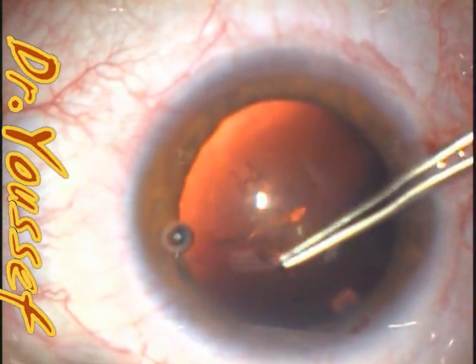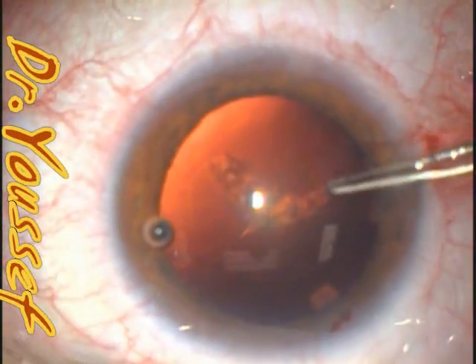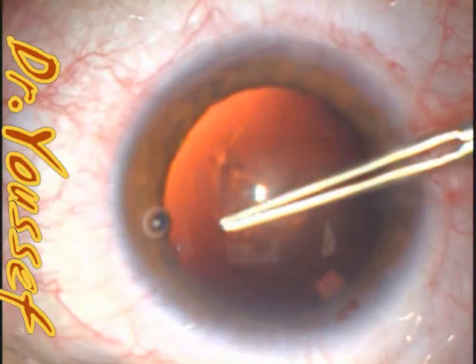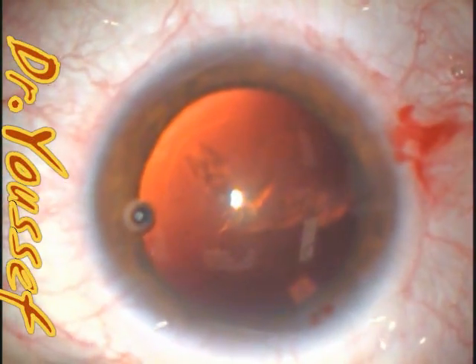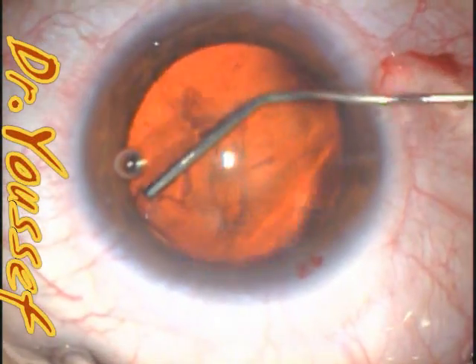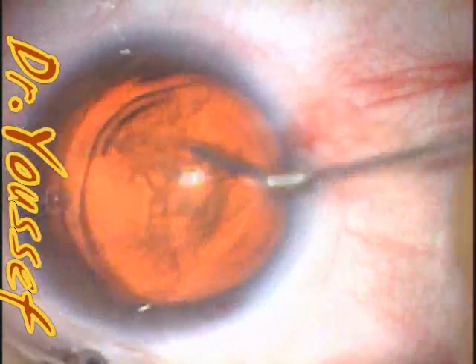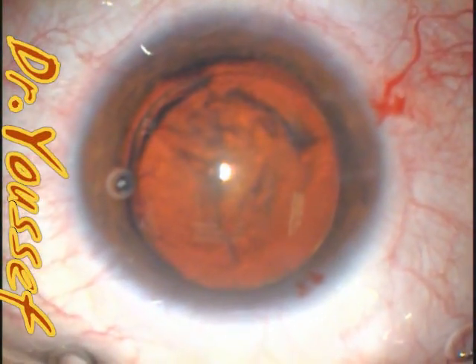When we implant single-piece lenses, they are folded and take time to unfold. While unfolding, the haptic can come out of the bag into the sulcus. If you don't confirm that both haptics are in the bag, you will fall into this trap. This results in long-term complications for the patient — pigment dispersion, sometimes uveitis, and glaucoma.